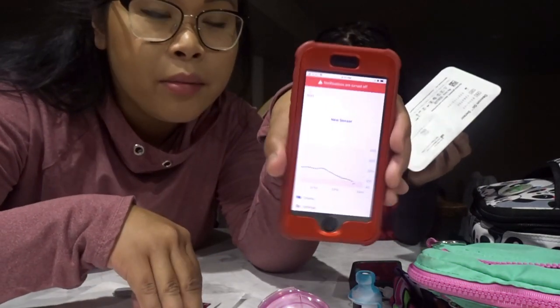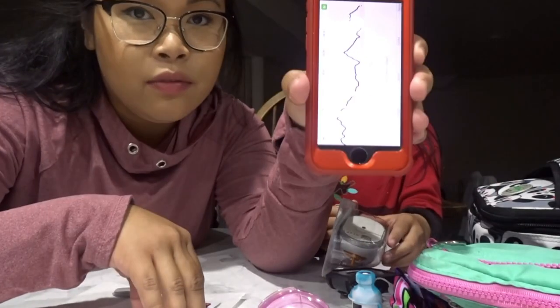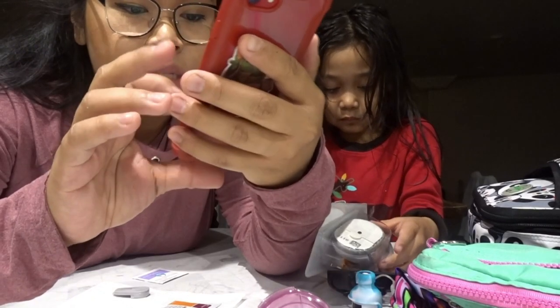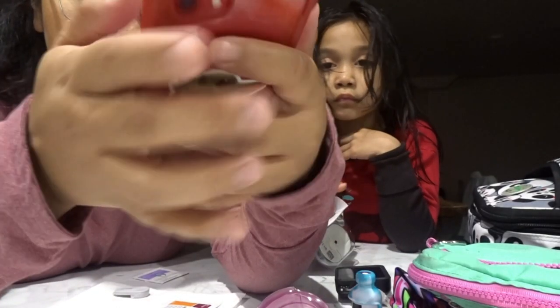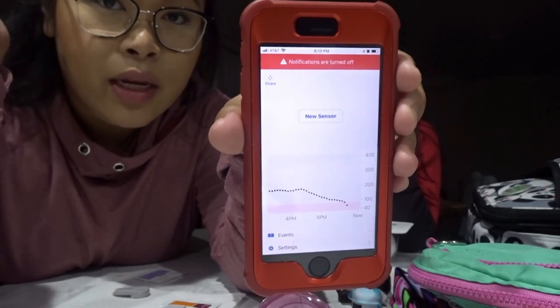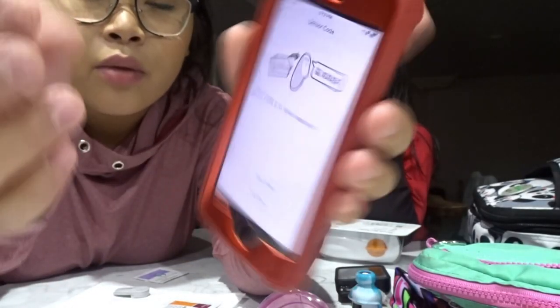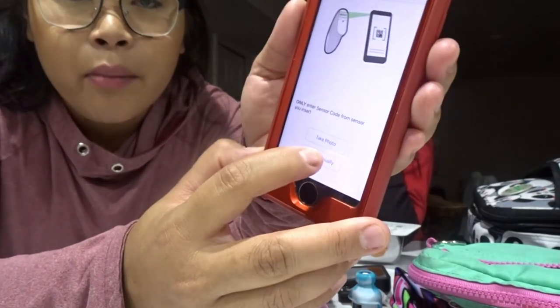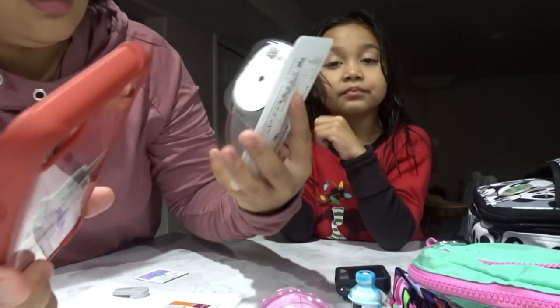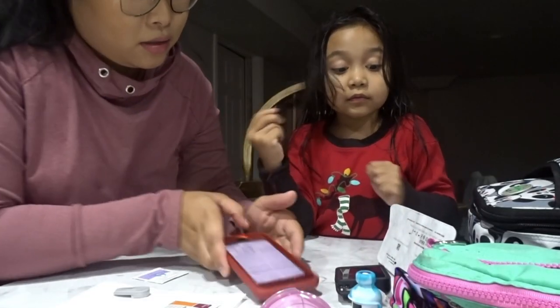You're going to get your receiver - your iPhone or iPod, whatever you use for receiving your readings. Go to settings, and either stop the sensor which is at the bottom of settings, or wait until your sensor expires. We waited until it expired, so we're going to go to New Sensor, press Enter Code, and enter it manually. Emma likes putting in the code - it's 9-1-1-7.